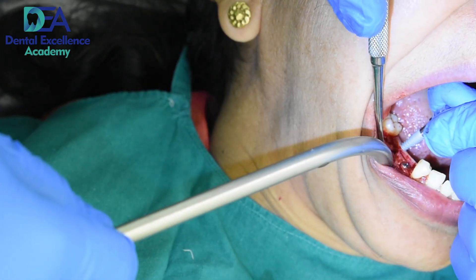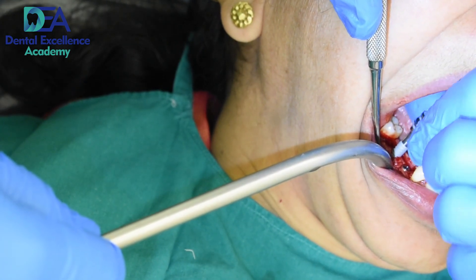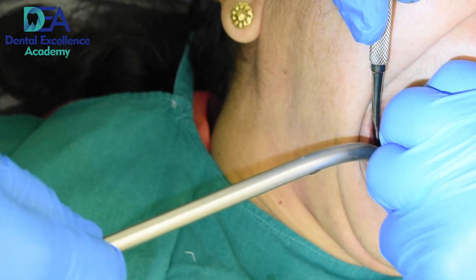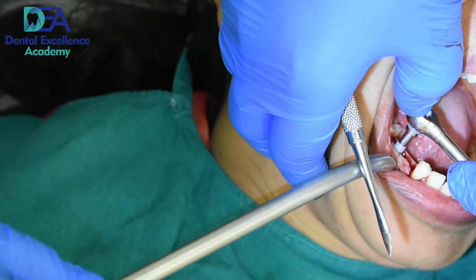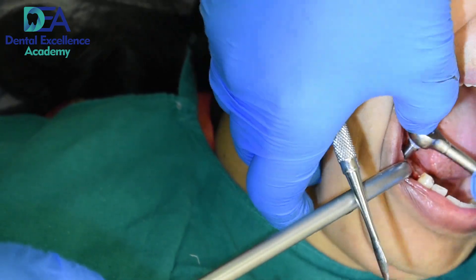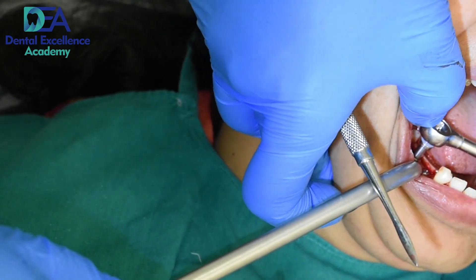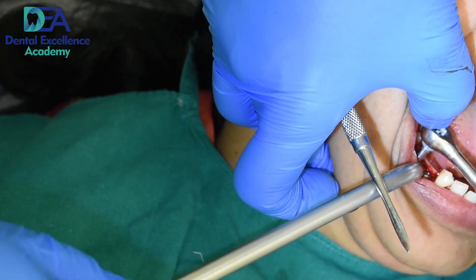Now we will place the implant in the 46 region. It is 4.2 by 11.5 mm. With the help of a ratchet I am going deeper so that I am at the desired position.